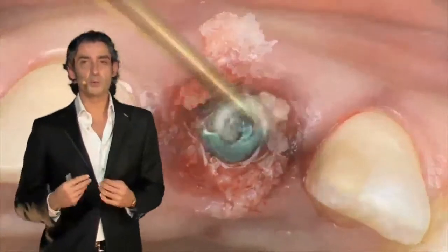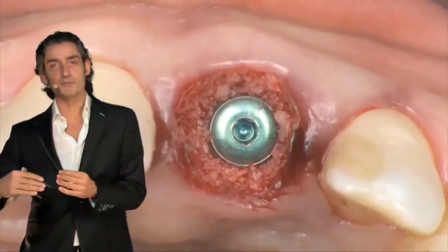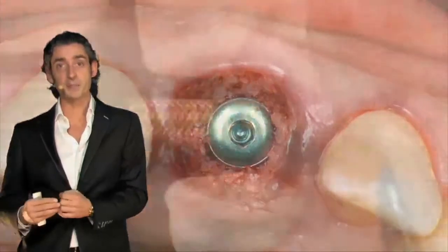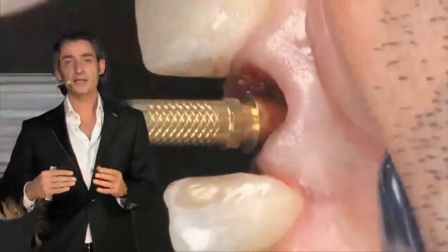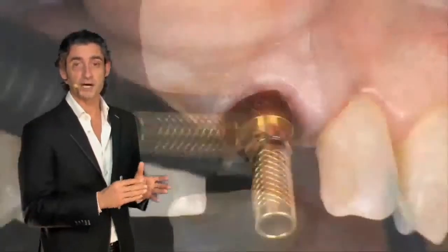And then what do we have to do? In this case I decided to avoid the final abutment at the time of the surgery, and I create a provisional restoration with a titanium temporary abutment.